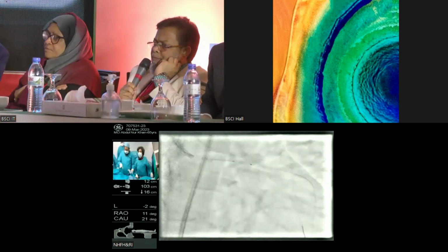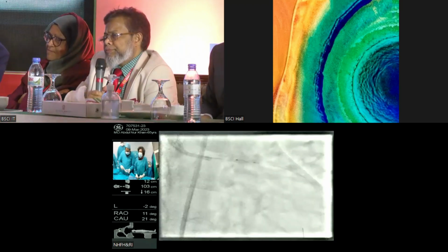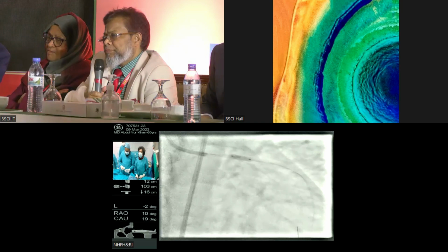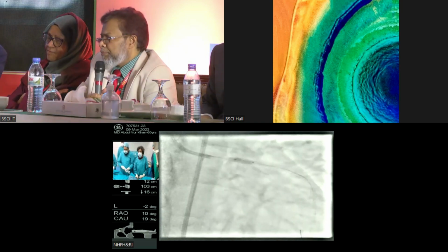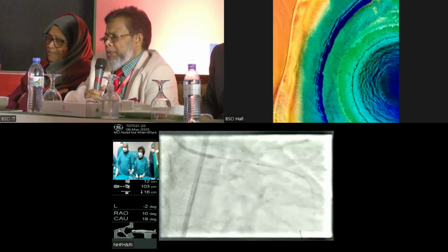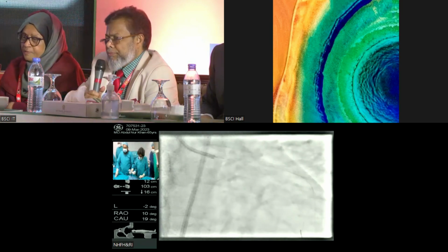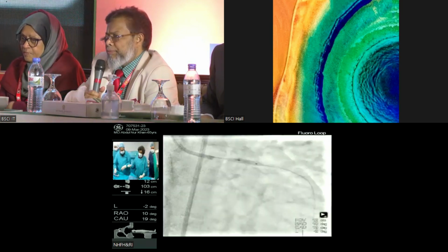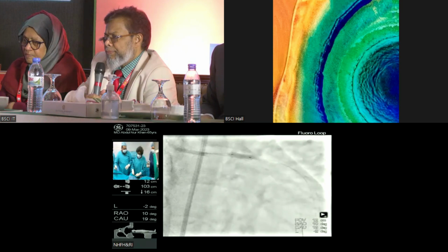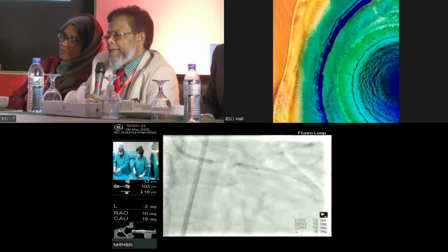So let me explain. The thing is that we wanted to see the extent of the calcium. We want to see whether this vessel really warrants atherectomy. And one of the key points by which you can decide upfront atherectomy is if it is a balloon uncrossable lesion, or if it is a balloon undilatable lesion. So here our balloon did go, but it was not dilating properly. And when we saw that, we immediately opted for the rota. But obviously, seeing the angiographic extent of the calcium and also the IVUS, we could have opted for the upfront rota technique anyway.